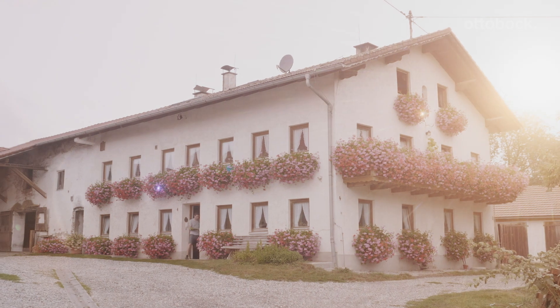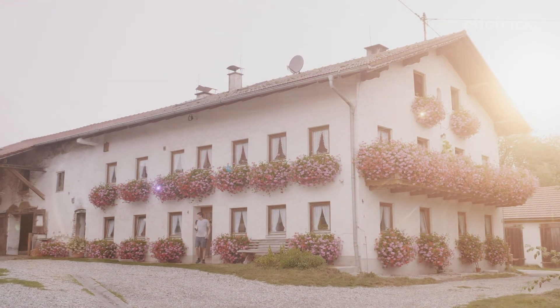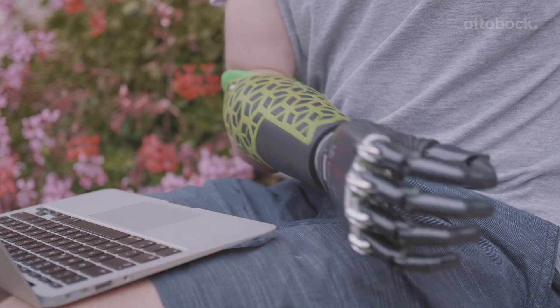My name is Wolfgang. I'm 23 years old and work on my parents' farm. I'd say that the Myo Plus control system can be controlled much more intuitively because you can use the actual signals that you previously used when your hand was healthy.